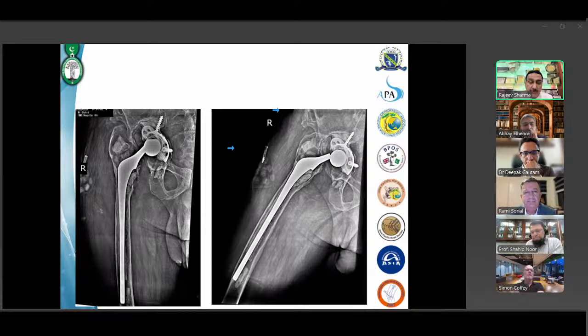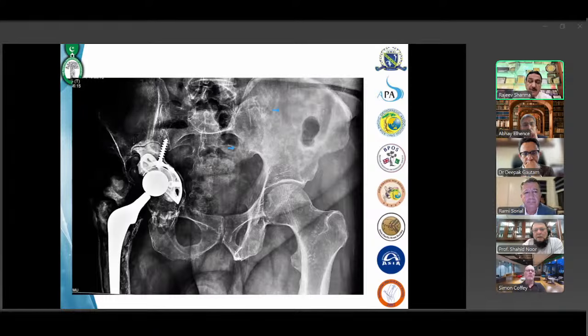Yes. Do you have the earlier X-rays of the patient? You need to assess whether the cage has moved medially over the years, or is in the same position. It has moved, medially as well as superiorly. We have a CT scan on this, and there's a column loss on the posterior side. So it's 3B, almost pelvic discontinuity. Yes, it is. And there is significant bone loss on the acetabular side.